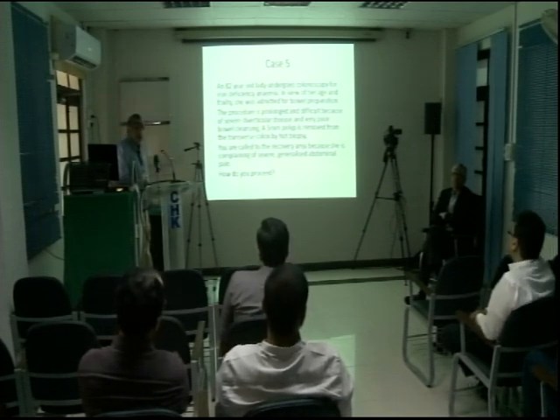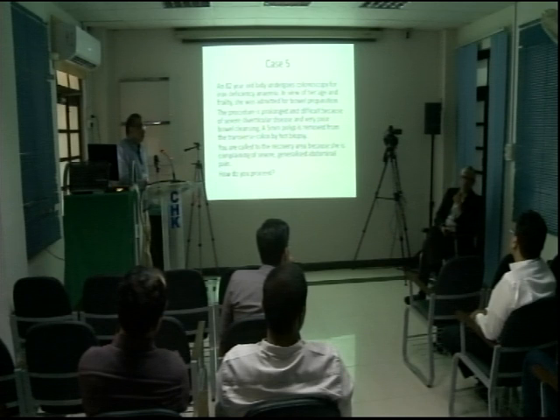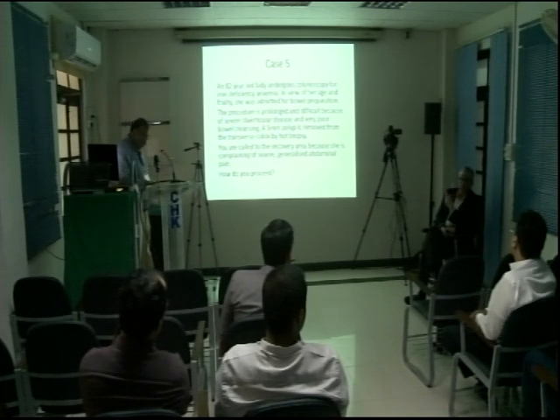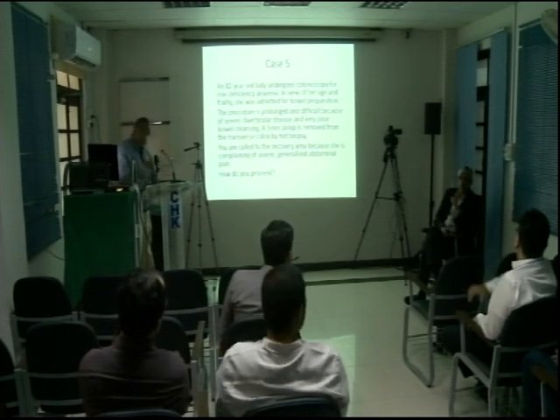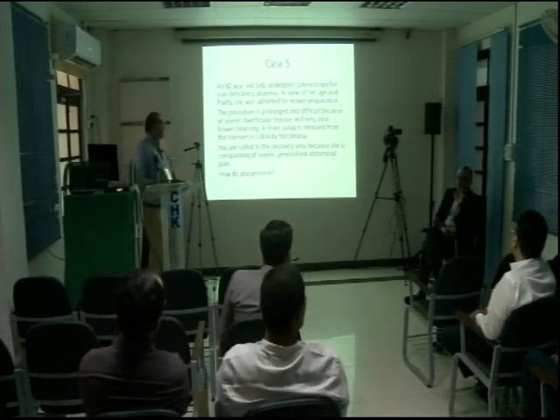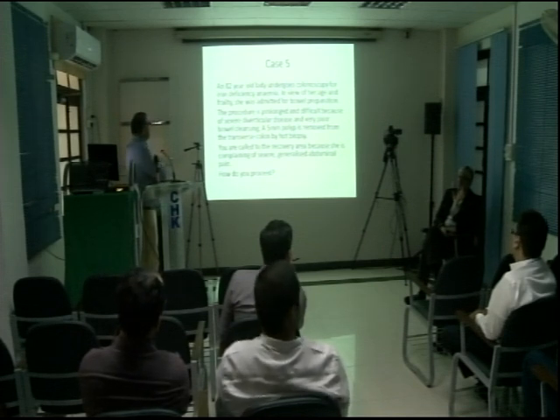हाँ. So prolonged procedure, okay. Stop there. Prolonged procedure, why? Longer procedure, more manipulation. No, why has she got a prolonged procedure? What is the reason? Because of poor visibility. Because of the bad bowel prep. बिल्कुल. Diverticular disease doesn't really prolong the procedure that much.